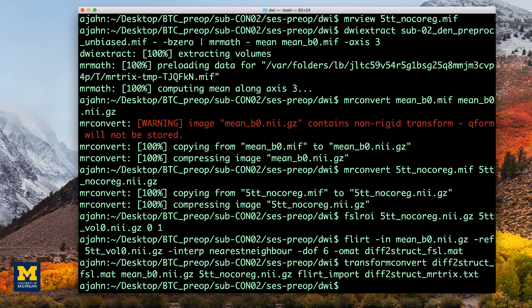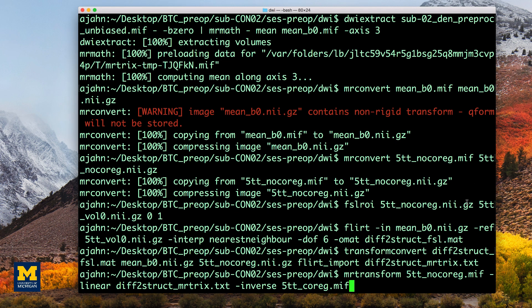Since we already have the steps to transform the diffusion image to the anatomical image, we can take the inverse of the transformation matrix to do the opposite. That is, we will co-register the anatomical image to the diffusion image.